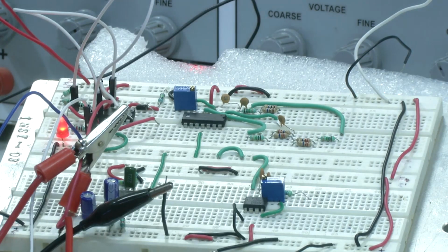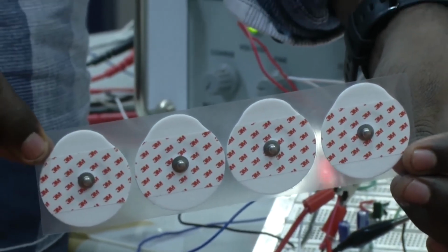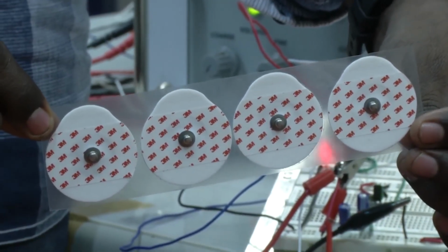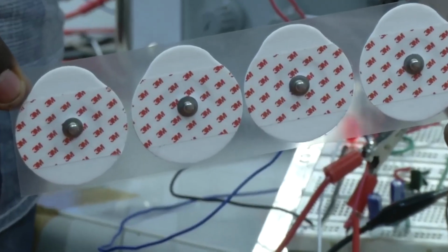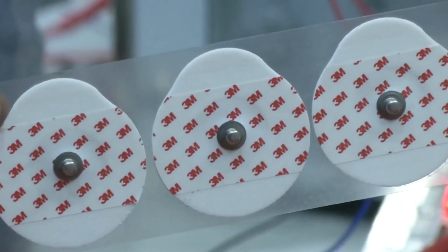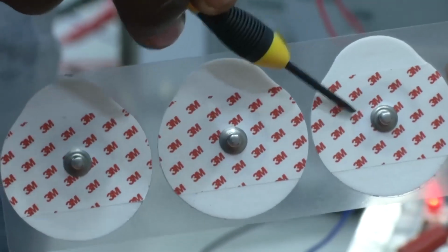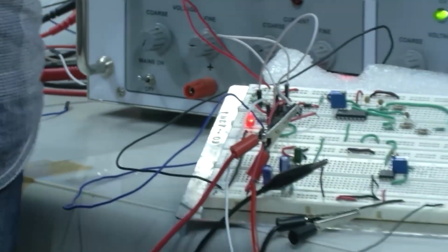Now, what we have to do is take a subject, or connect a particular person, and connect the ECG electrodes. So, these are the ECG electrodes connected to the person. One at the right hand, another at the left hand, and the ground at the right leg, which we discussed at the start of our experiment, right. And here we will connect the electrodes to these metal pins, and we will see whether we are getting the ECG signal or not in an oscilloscope.